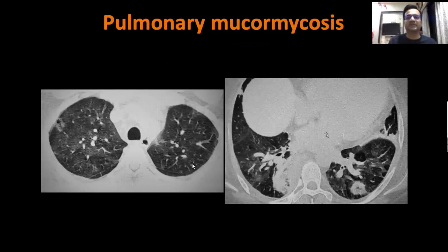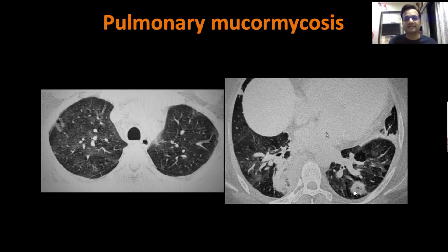Here is one typical example. You can see ground glass lesions typical of COVID-19 — likely in a resolving stage — and in addition the patient has started developing a large nodule or consolidation with central ground glass attenuation. There is a clear reverse ground glass halo. No matter what, if there is clinical suspicion, this is not going to be COVID-19 or aspergillosis. This is more likely to be mucormycosis, and you should always raise this possibility.